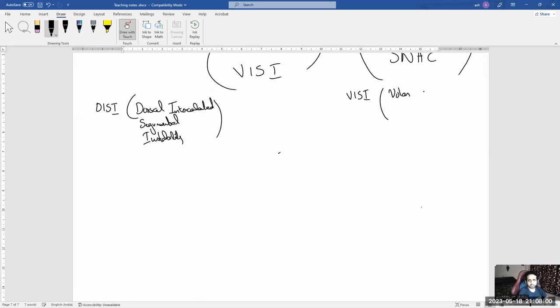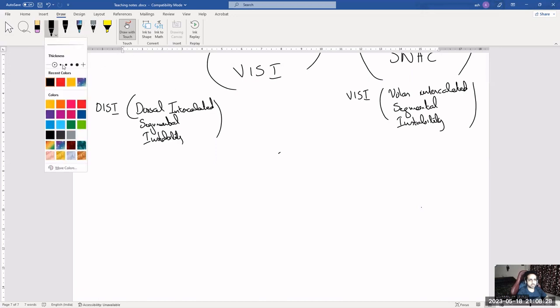Volar intercalated segmental instability. Okay, so let's see what these two things are.